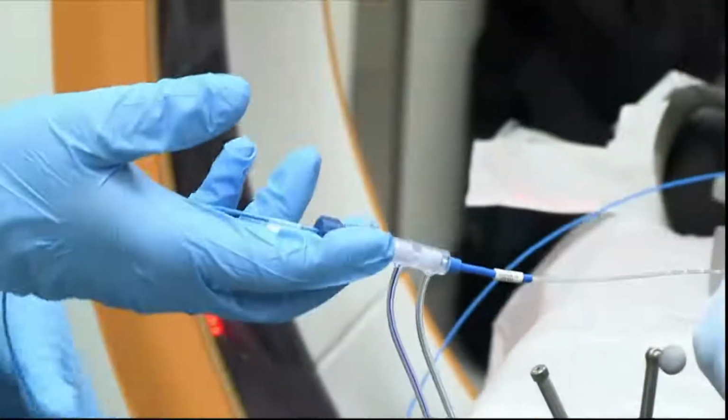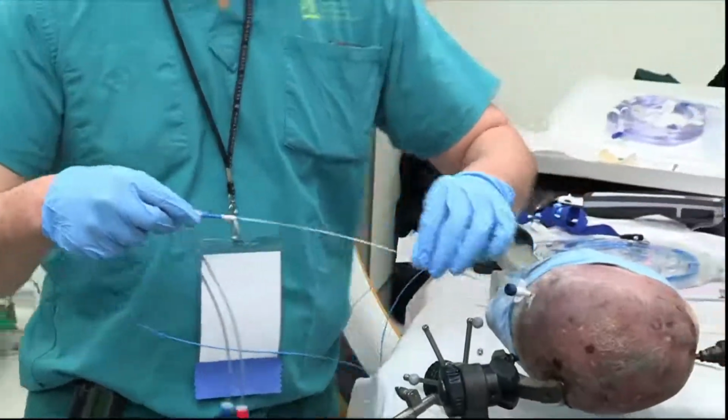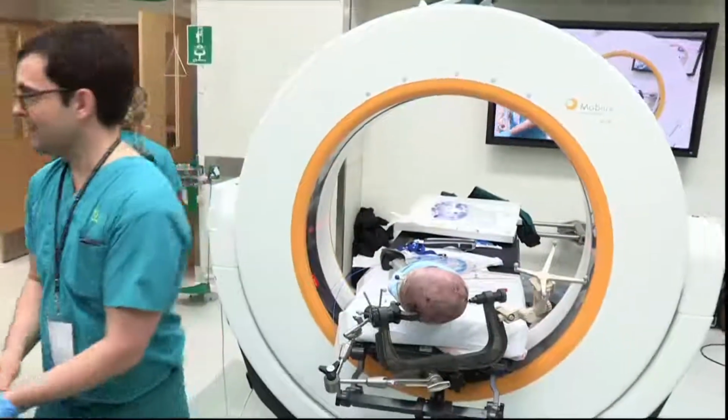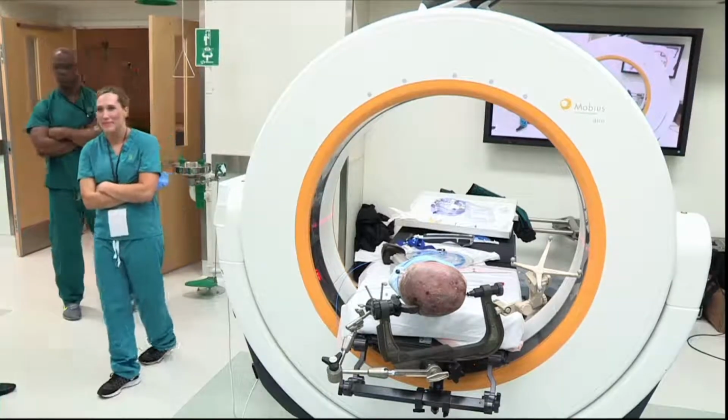Okay, great. Let's go do the ablation. Okay. Perfect. So, what is on my, oh, that's the.